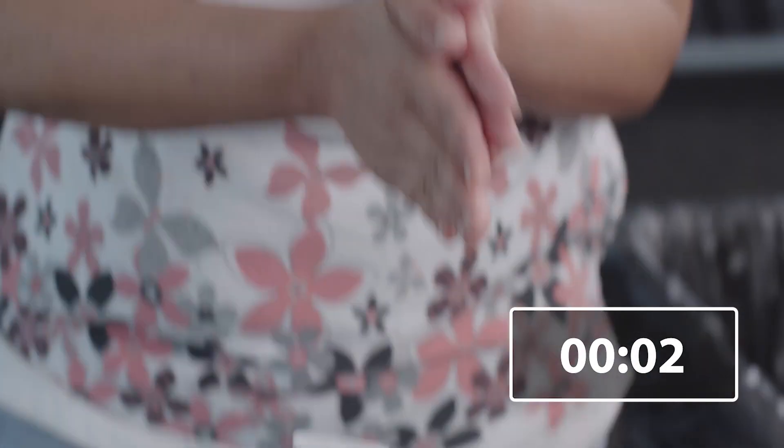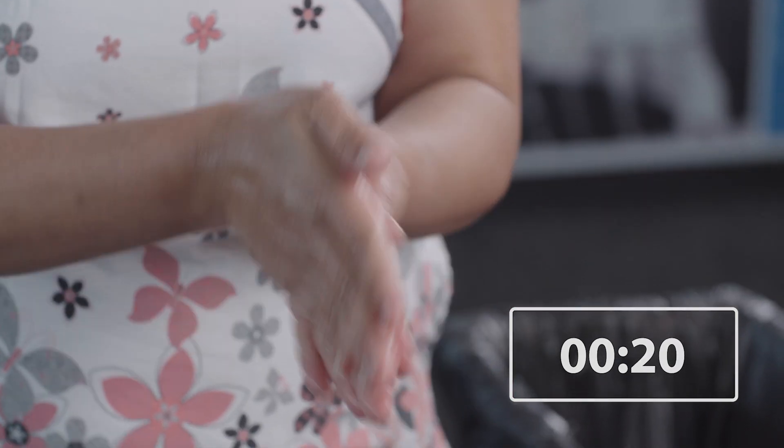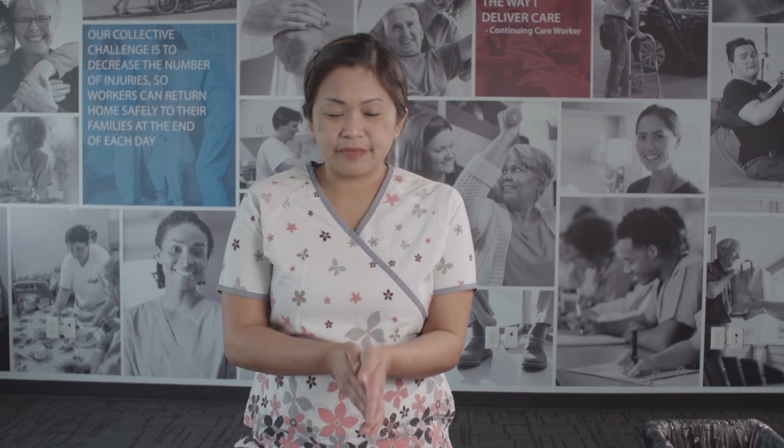Once again, perform hand hygiene with alcohol-based hand rub or soap and water for at least 20 seconds. You have now completed the doffing procedure.